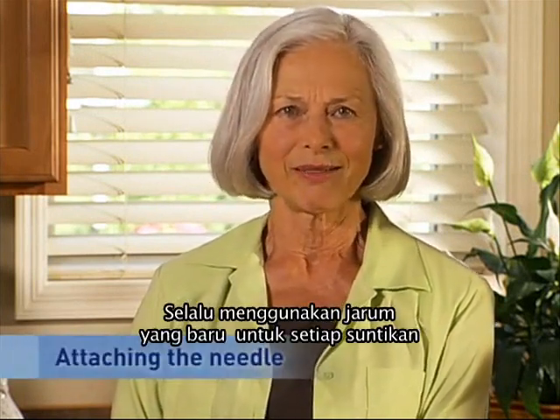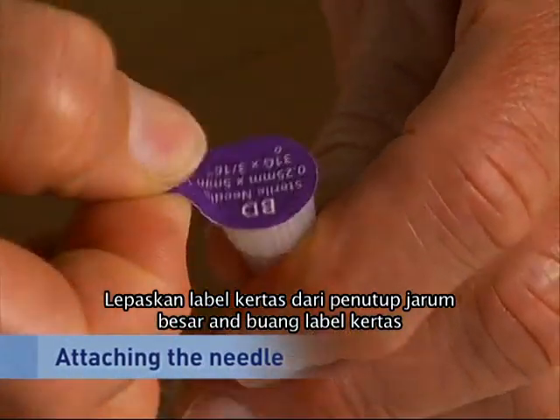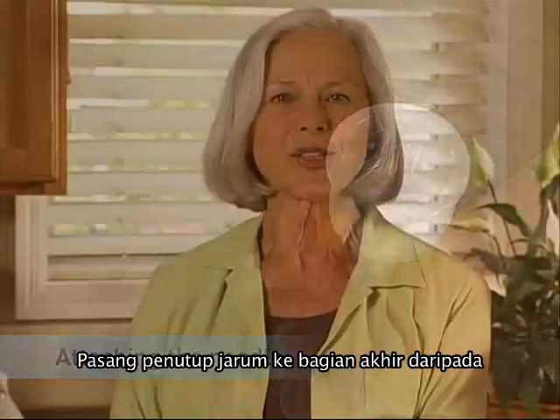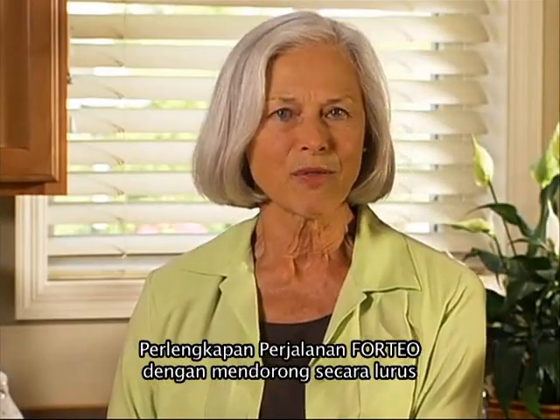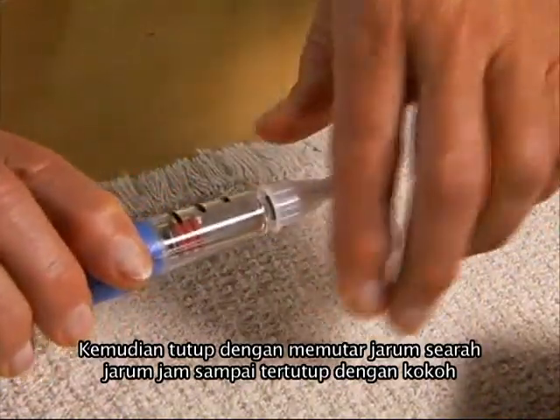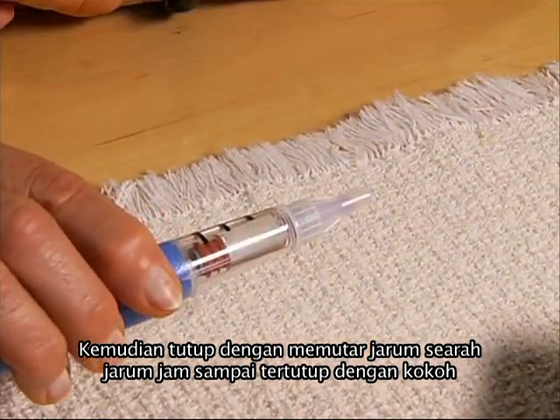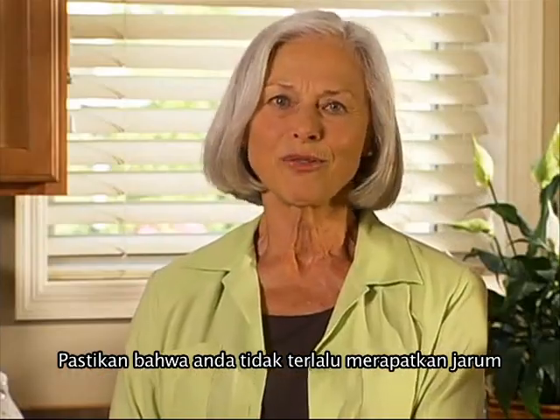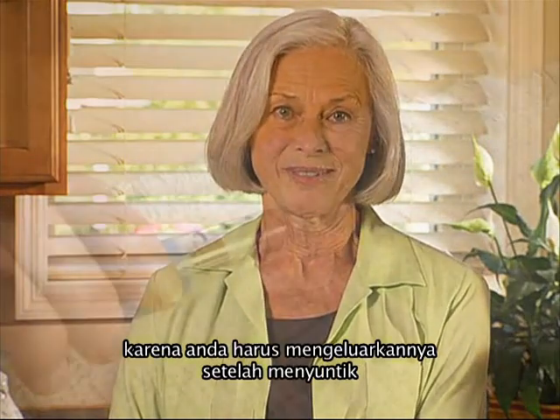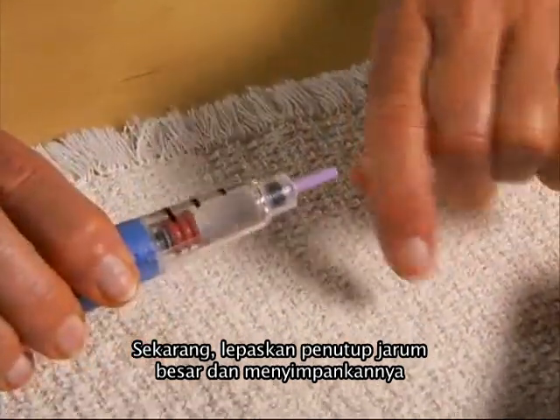Always use a new needle for each injection. Pull off the paper tab from the large needle cover and throw the paper tab away. Attach the capped needle to the end of the Forteo delivery device by pushing it straight on. Then, screw on the needle in a clockwise direction until it is firmly attached. Make sure that you don't over-tighten the needle, since you will be removing it after the injection. Now, pull off the large needle cover and save it.